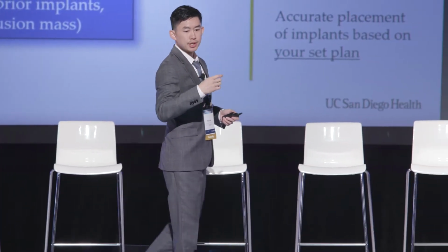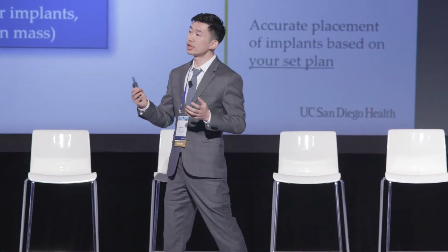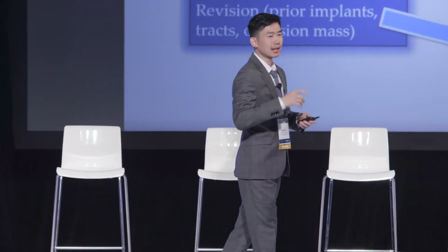With this pre-op planning software, that means that when you've already gone over the software and you've looked over your own patient's CT, like I mentioned earlier, you've already determined the entry points, the trajectories, the screw diameter and the length. And because you're looking at your patient's CT scan, you're already reviewing pitfalls such as large facets, small pedicles, scoliotic curves, or revision pitfalls such as fusion mass, prior trajectories, or implants that are in your way. All of this is being reviewed as you look at it. You develop the plan, you put it into the robot, and now the robotic arm will assist you in helping you execute what your plan is.